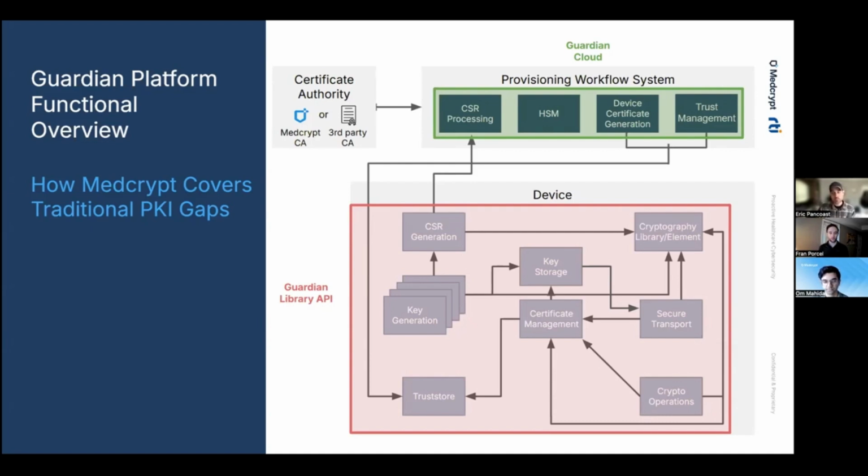it doesn't mean the device is actually operating securely. And we'll see that in a little bit here. Proper trust is required to enable security that satisfies the FDA cybersecurity guidance for medical devices. So in this infrastructure here for the Guardian platform, in order to properly secure a device in this manner, we need to establish that trust of the cryptographic keys in the medical device.